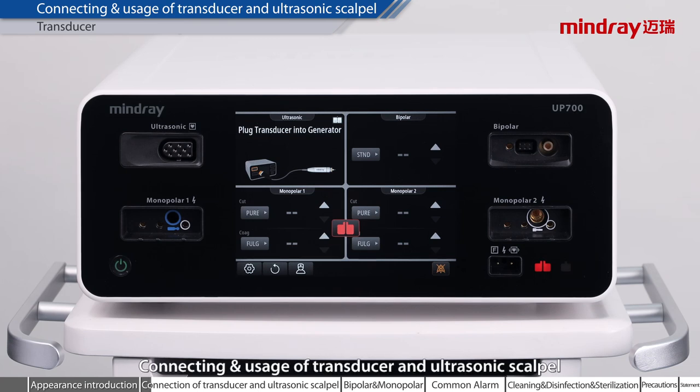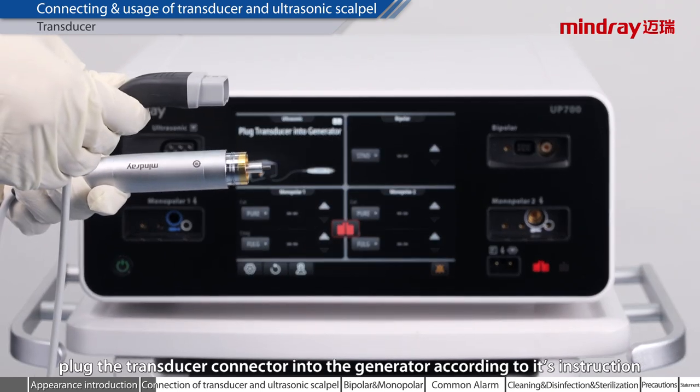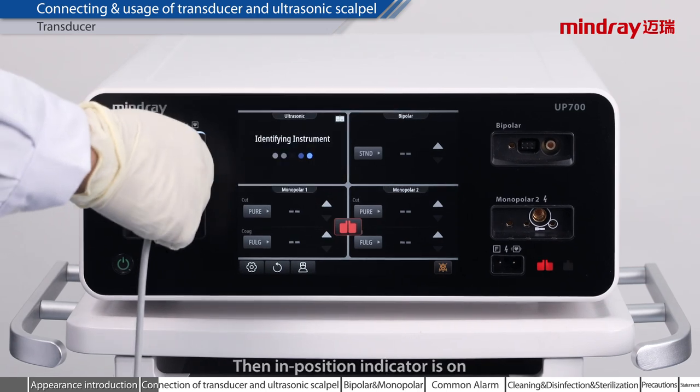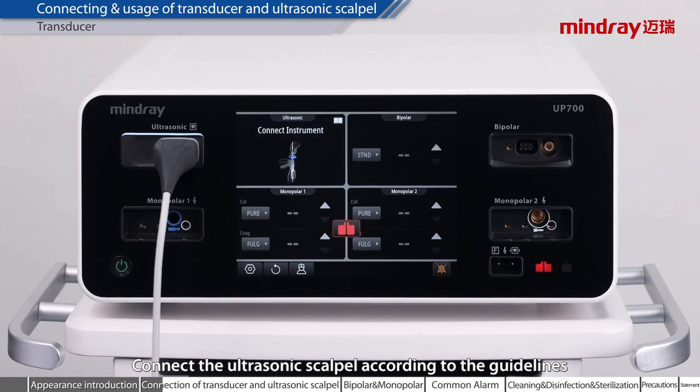Connecting and usage of transducer and ultrasonic scalpel. Firstly, plug the transducer connector into the generator according to its instruction. Then, the in-position indicator is on. After successful device identification, connect the ultrasonic scalpel according to the guidelines.